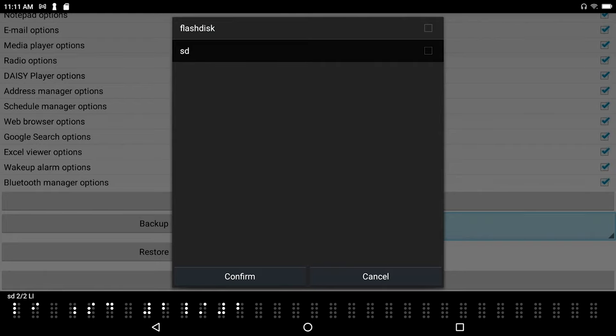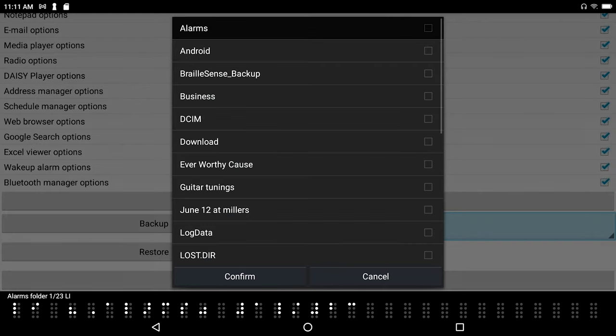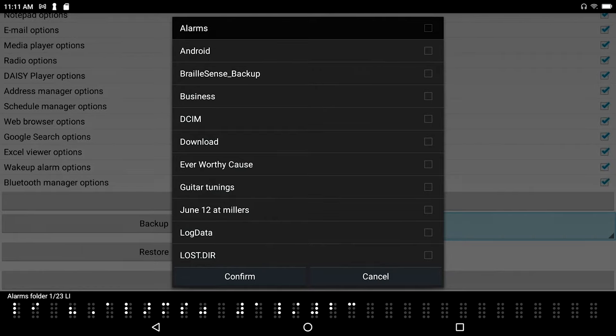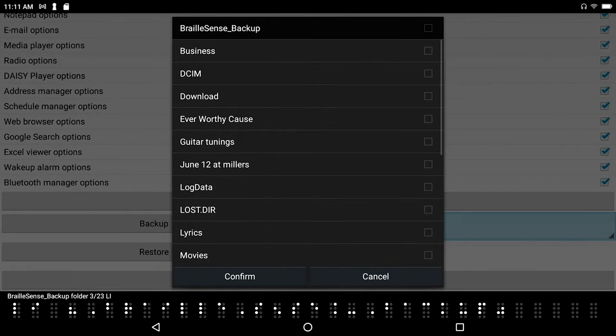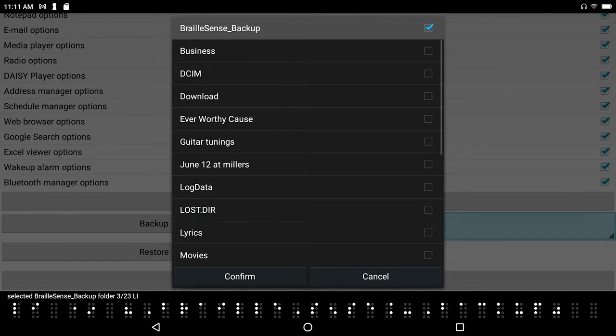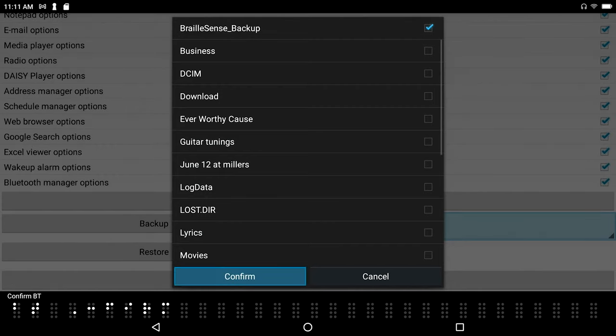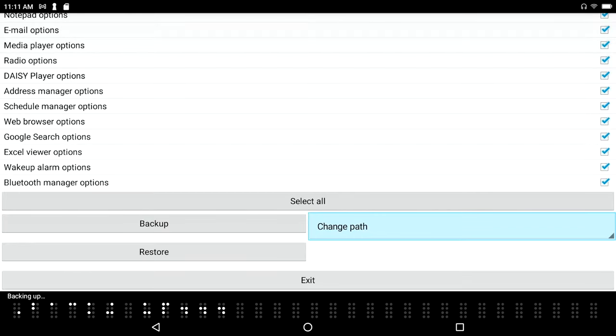Let's say that I want to go ahead and backup, or 1 of 23 list item. Okay, down arrow, space dot 4, Android folder 2 of 23, Braille Sense backup folder 3. There's my Braille Sense backup folder. I'm gonna press space on that, selected Braille Sense backup folder 3 of 23 list item, and I'm going to simply confirm button, confirm.